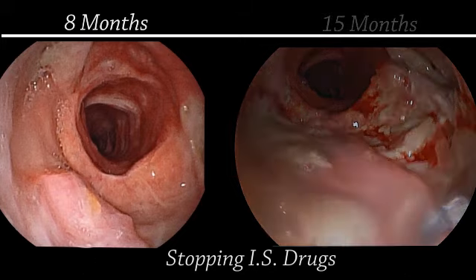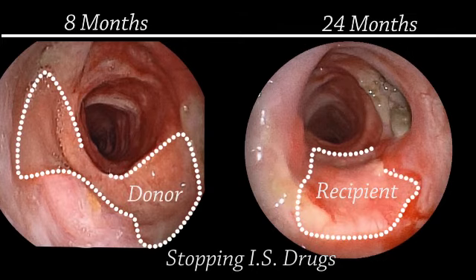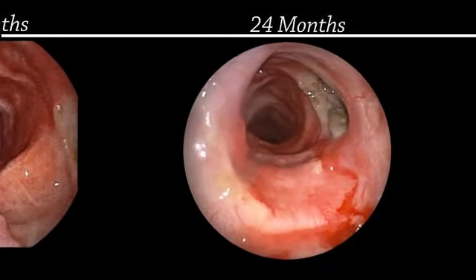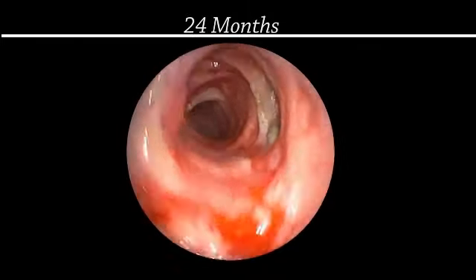The endoscopy 2 years after orthotopic transplantation and 1 year after stopping immunosuppressive drugs shows a fully healed transplant. The site of the recipient's mucosal lining has enlarged compared to the situation during withdrawal of immunosuppressive therapy. The airway lumen is reduced at the sites of the rejected donor mucosal lining. 2 years after orthotopic transplantation, the reconstructed airway is stable and safe.